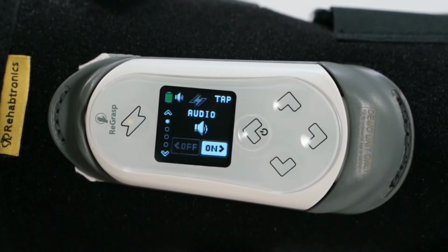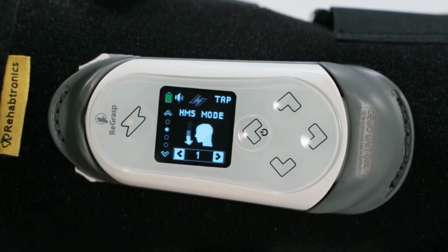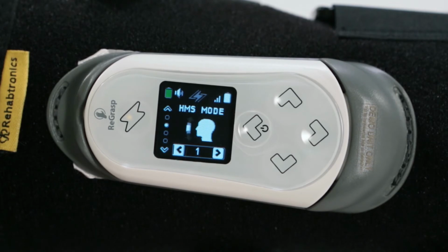Let's go ahead and try the down-up motion. Select head motion, number 1. Watch the video demonstration and try to replicate the motion. When the head motion is detected, the stim screen will display a check mark, and if the audio is on, it will beep. Practice a few times.